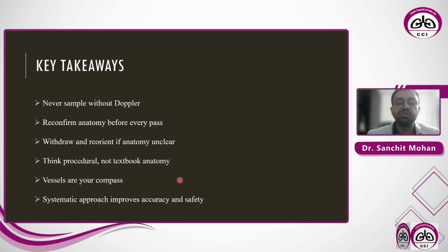Vessels are your compass. So you should learn by heart where exactly to screen for the vessels, because if you learn about the vessels, then you'll be able to easily locate the lymph node. Systematic approach improves accuracy and safety.